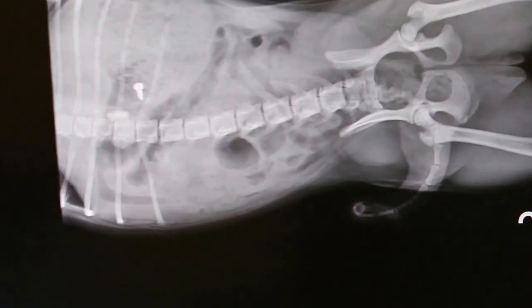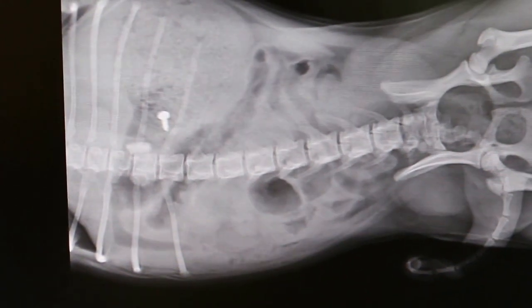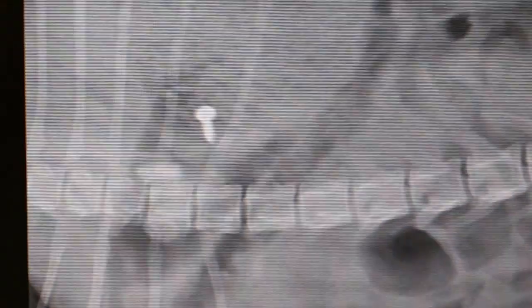The X-ray is blurry. Which one is blurry? You can see — blurry. Which one? The X-ray?